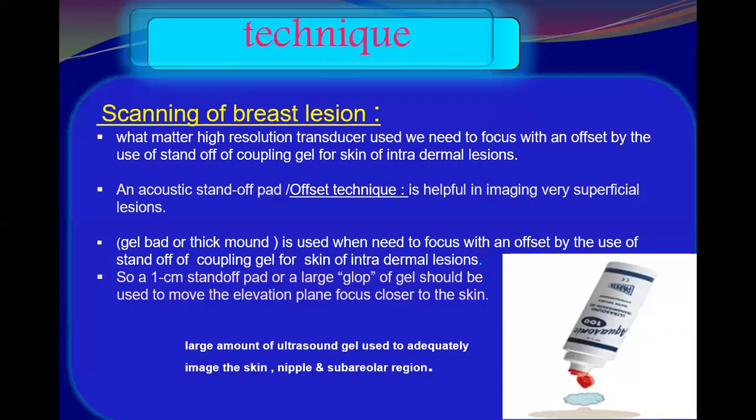Okay, so again, if we identify a lesion, sometimes we might need to use an offset technique. What is an offset technique? Or acoustic stand-off technique.